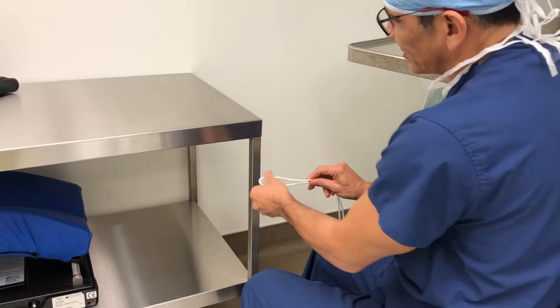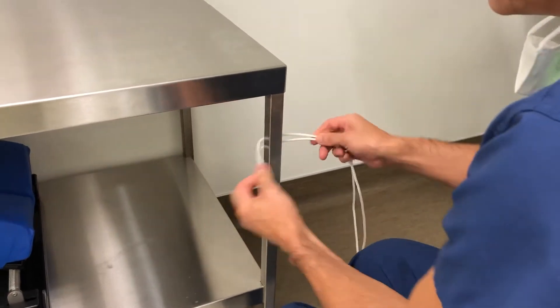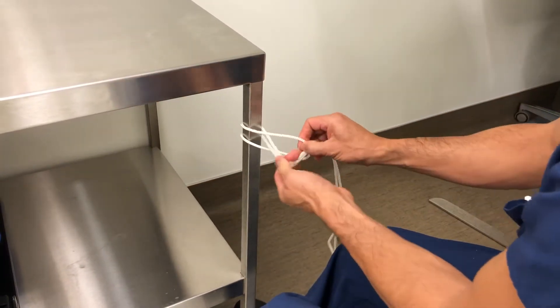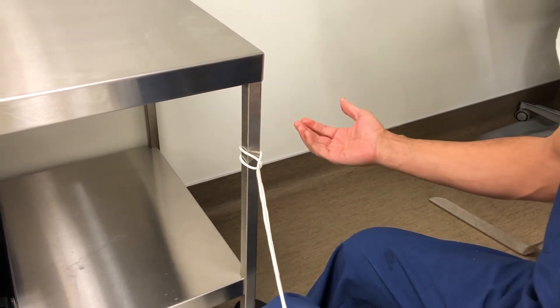I'm trying to perfect my luggage tag stitch. I use a luggage tag whenever I do subscapularis repairs. You pass a loop, you pass a loop, and then after the loop is passed, you pass the two limbs, and voila, you have a luggage tag. Very simple stitch, it's pretty fast, it's pretty nice.